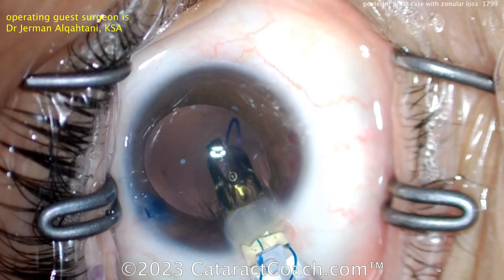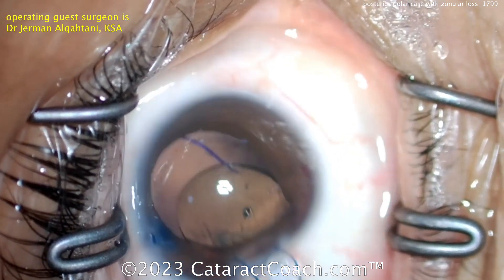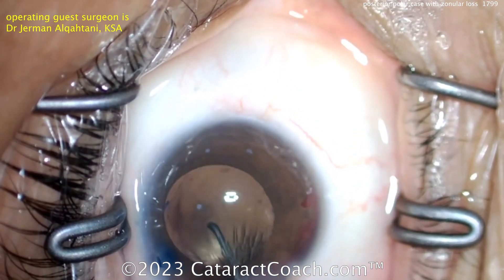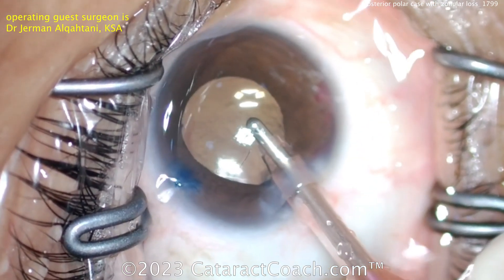The three-piece lens going inside — let's get that lens in. There's the 7-L rule: first haptic resembles the number seven, trailing haptic looks like the capital letter L. Get that pushed inside into the capsular bag, and that looks pretty stable. End of the case — finished very nicely managed.